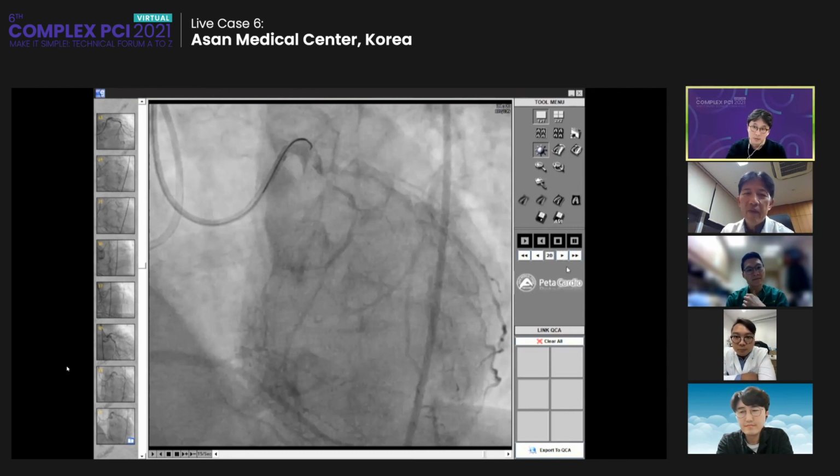So based on this information, I mean, the failure mode of another hospital, the CT, and our baseline angio, what kind of strategy do you want to select? Antegrade first again, or a retrograde approach? Because we now know that there is a candidate for the retrograde, not a bad one. So would you just do a primary retrograde, or deal with another antegrade session? How about your opinion? Maybe Dr.